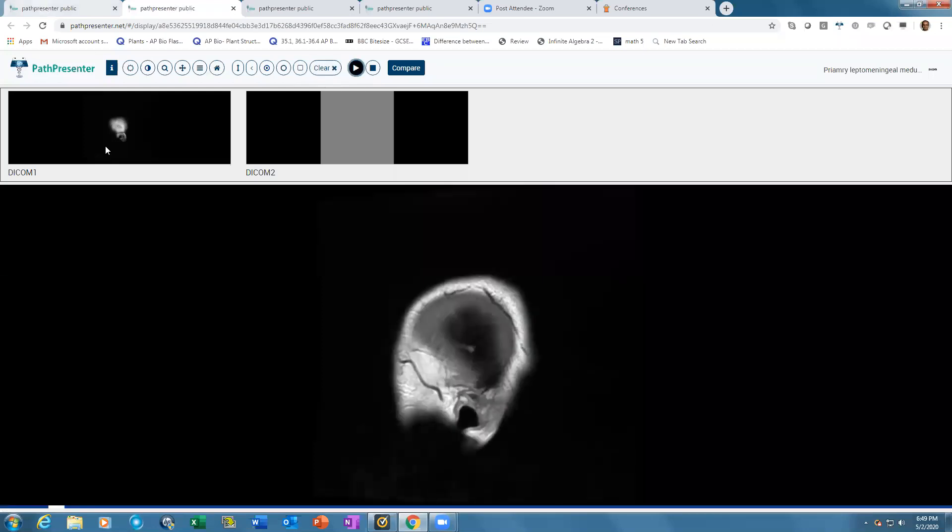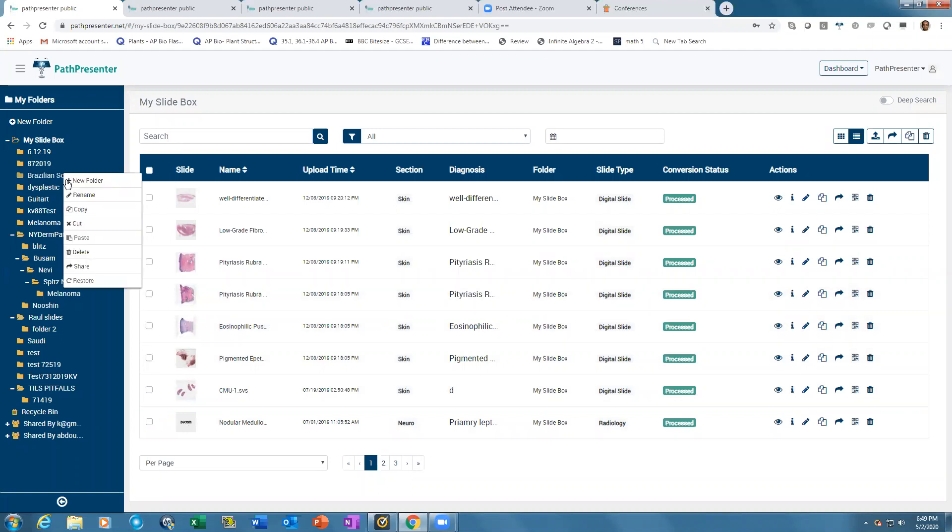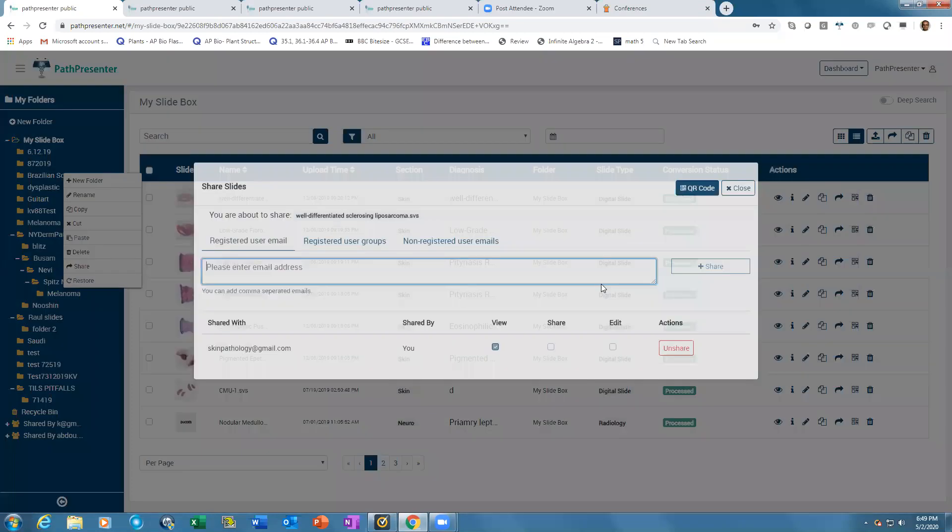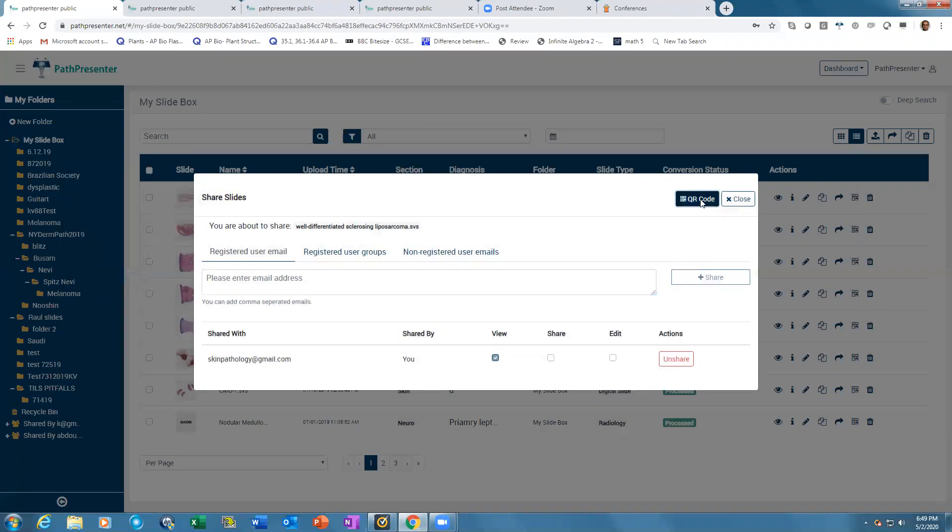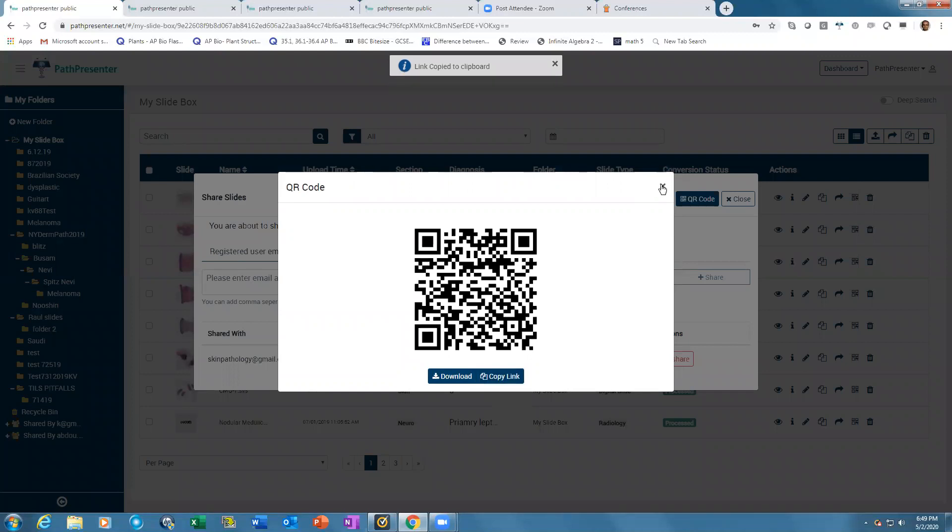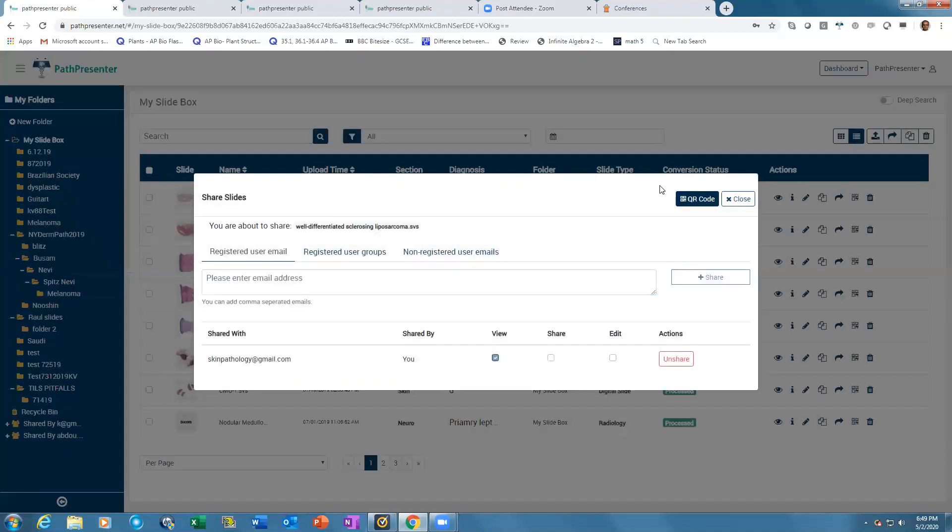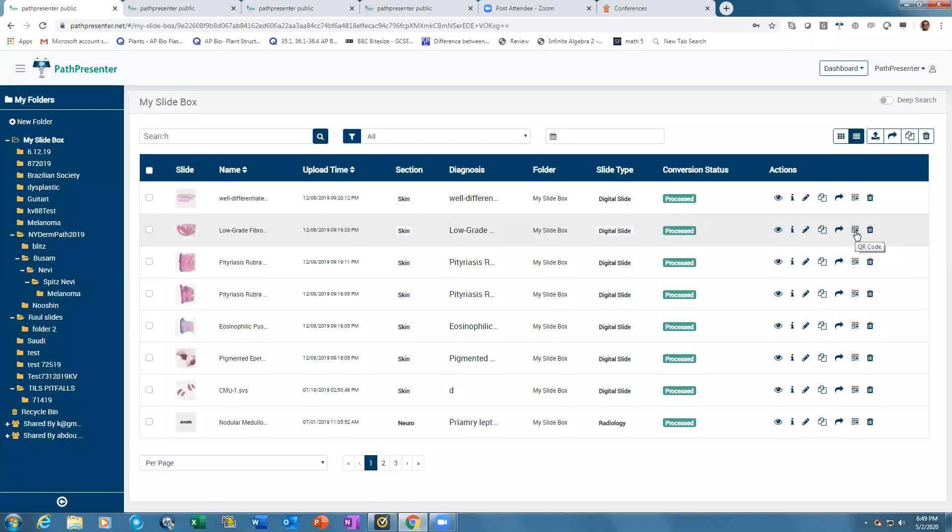You can share entire folders or individual slides with people around the world using the share icon. Enter an email address for a single person or group, or download the QR code or copy the link. Put the link in social media or email, and recipients can immediately open the slide. QR codes can be put on posters, publications, and journals for phone access.